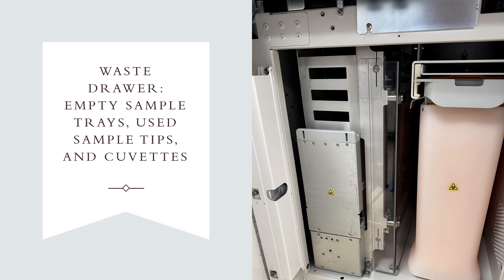The drawer is located beneath the sample tip tray loading dock shown in the previous slide. The small red circle indicates a manual way to open the tip tray waste if the analyzer will not open it by other methods. The green circle is where used sample tips and cuvettes are disposed. When troubleshooting tip tray error jams, make sure to empty all of the waste bins and check for any additional obstructions.